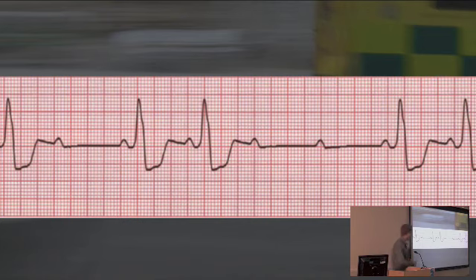So it's tempting to think it could be a complete heart block because of the broad QRS complex, isn't it? And you might think that's a ventricular origin. But with complete heart block, you're going to have complete dissociation between the atria and the ventricles. No relationship whatsoever. Whereas with this, you've got these beats that are definitely being conducted. So it's a type 2 heart block. So type 2 means that you're just missing some beats. You've got conduction, but you're missing some beats.